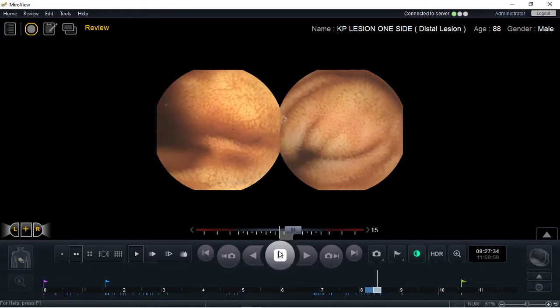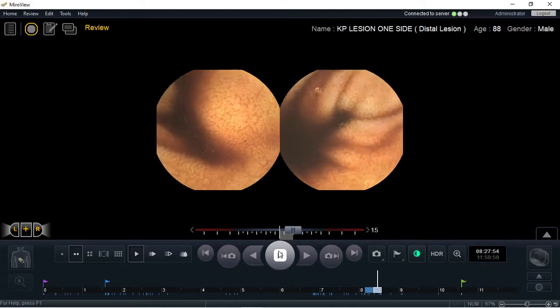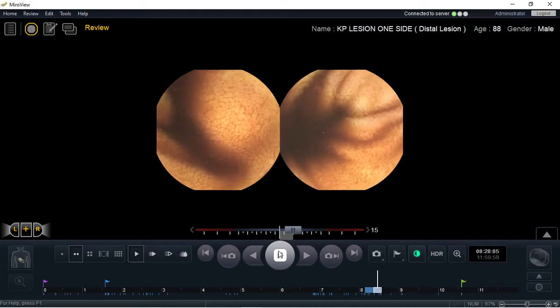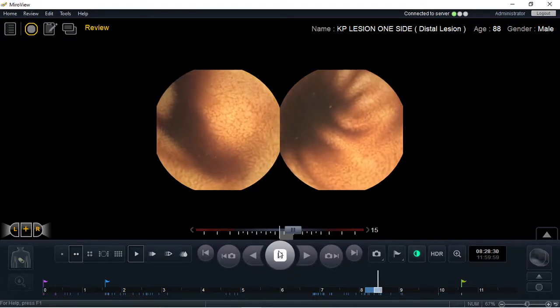Hi, this is a demonstration video on the double-tipped double-headed capsule by Intramedic using the Miocam software. This video will demonstrate the importance of using the double-headed capsule versus single-headed.